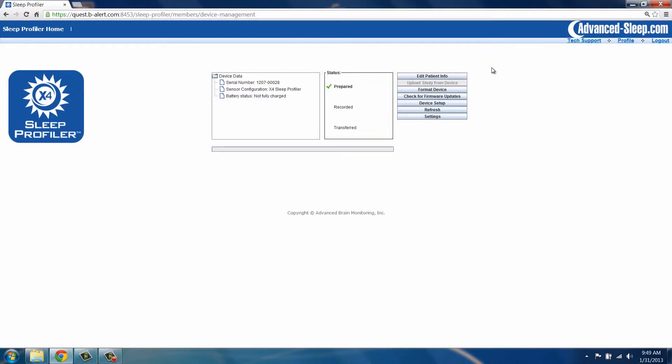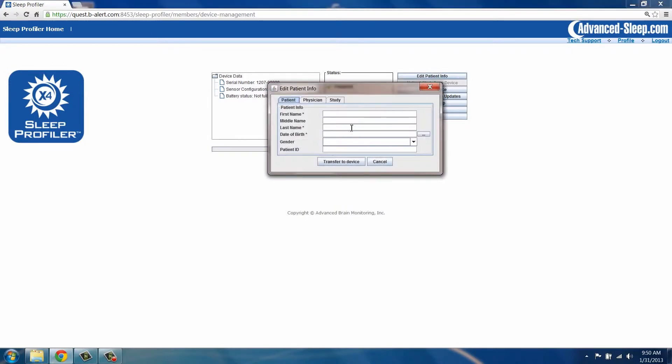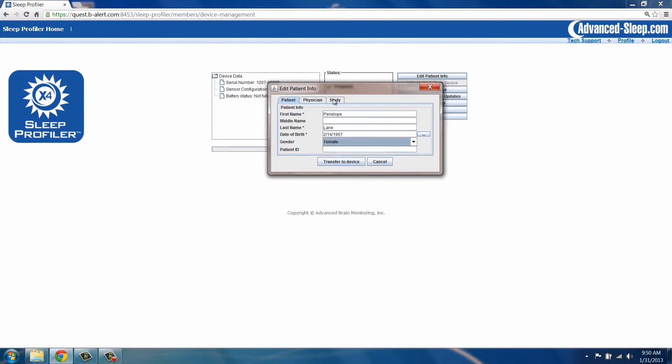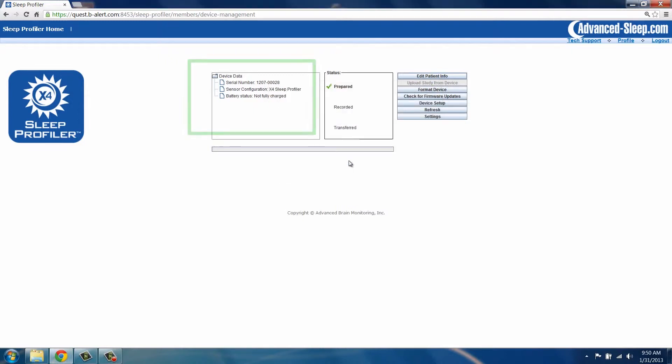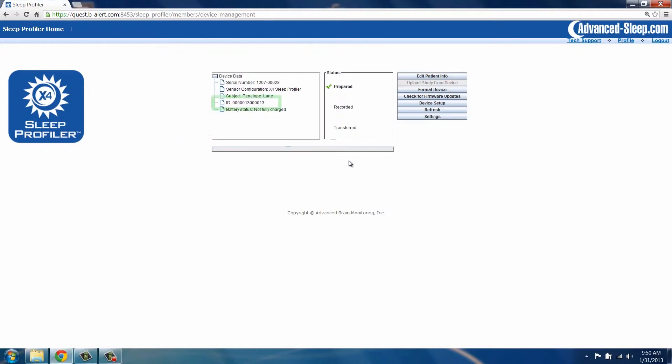Click on the Edit Patient Info button. Enter the information on the Patient Info tab. Use the Study tab to select either a diagnostic or treatment follow-up study. Click Transfer to Device. This transfers the patient information to the portal database and downloads a study reference number to the device.